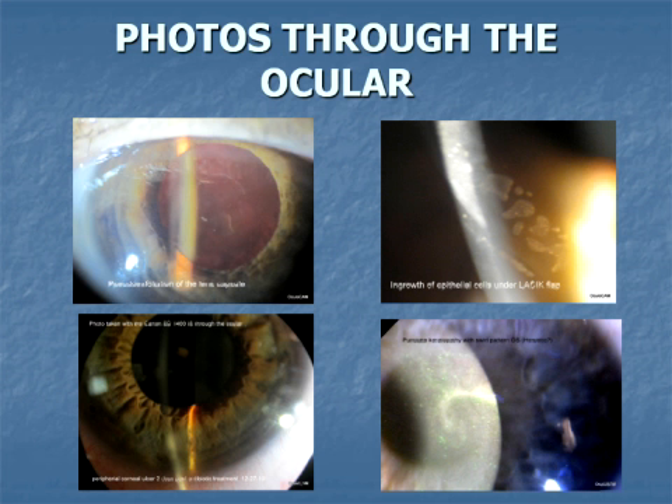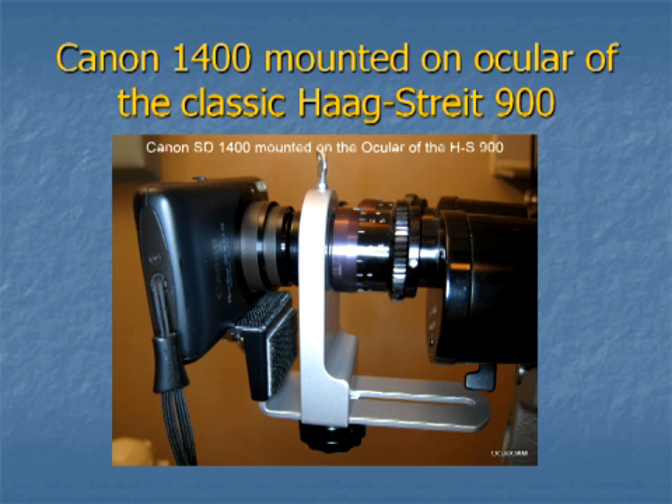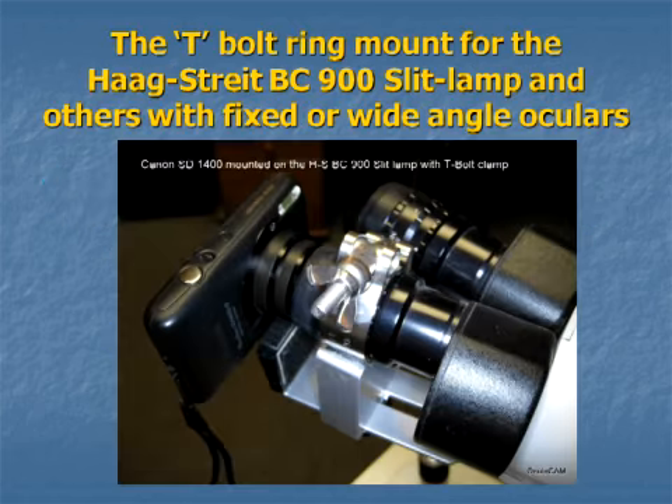Generally, mounting the camera on the right ocular is the most convenient because of the asymmetry of the camera's lens position. In the second generation or universal model of the Oculocam system, there are two devices provided for mounting the camera on the ocular. The original ocular mount uses the chrome ring of the removable 10x ocular of the Hogstrike 900 for support. The new universal T-bolt ring clamp uses the ocular itself or the knurled ring behind it, depending on the slit lamp model.